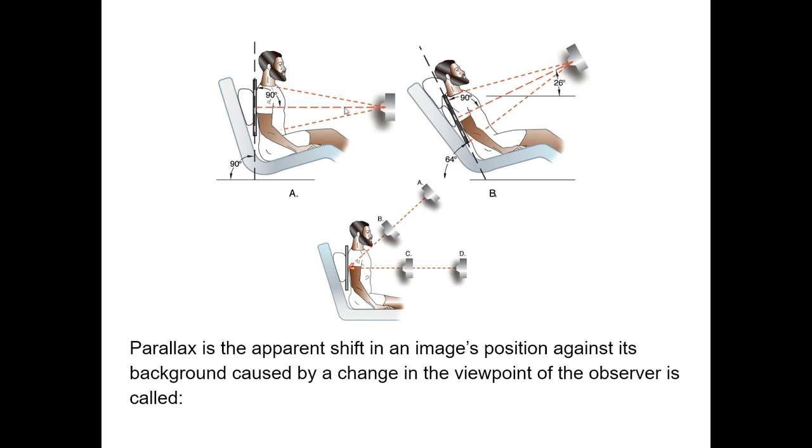But this is what we do if it's a regular chest x-ray. We get the patient as straight as we can. We never have them do this unless they order a lordotic image, which is rare. Anyone ever see them order a lordotic image? They do with the clavicle. Oh, for the clavicle? That kind of makes sense. Except usually even with the clavicle, you won't have the patient do that. You'll just angle up instead, which would achieve essentially the same thing.